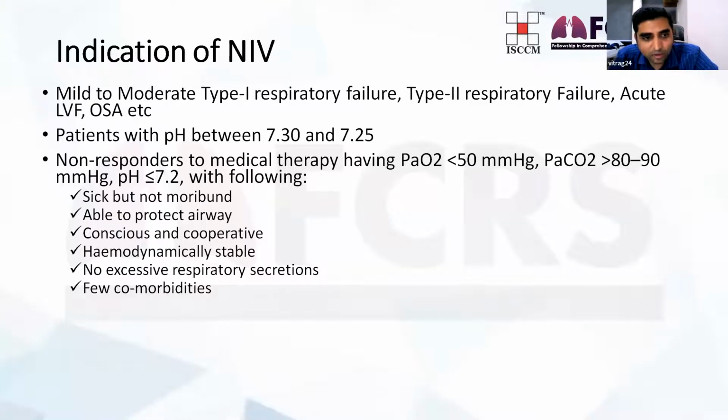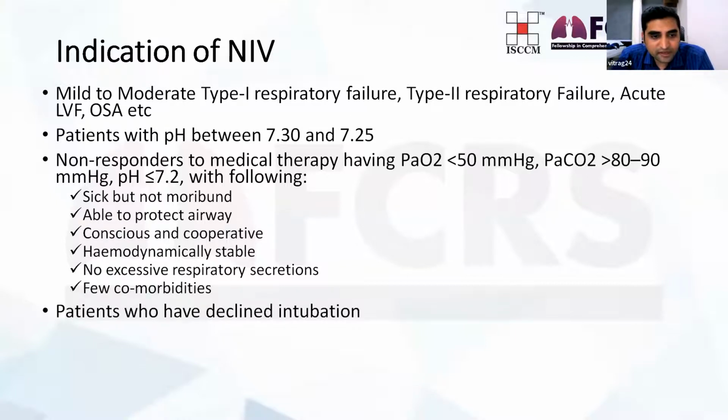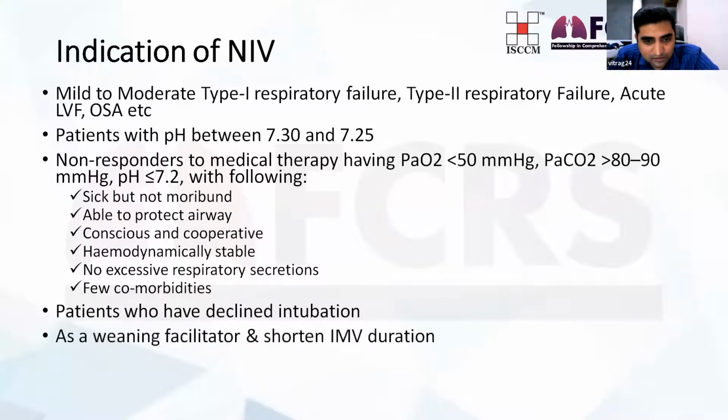Patient is sick but not moribund, patient is able to protect the airway, patient is conscious and cooperative, patient is hemodynamically stable, there is no excessive respiratory secretion, and there are few comorbidities. So if all these parameters are met, we can try with NIV and keep SOS intubation and invasive ventilation ready. Or we can use NIV in patients who have declined intubation and still want to opt for other treatment.